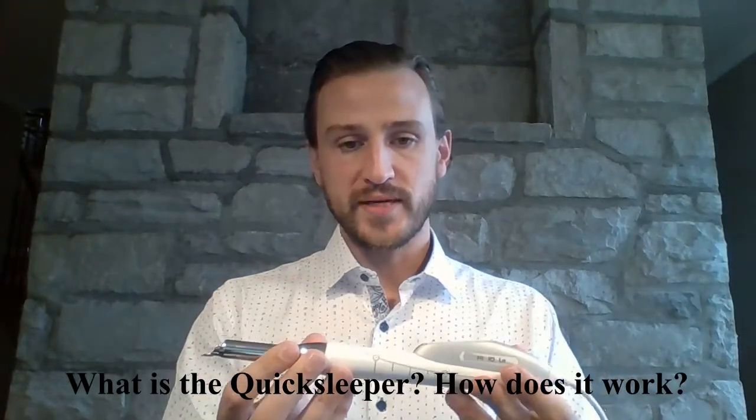Hello everyone, Trevor here from RWR Dental. I'm here to talk about what is the Quick Sleeper and how does it work. The Quick Sleeper is an electronic anesthesia delivery system that completely replaces the need for the syringe and the traditional nerve block technique, which is proven to be inconsistent and sometimes very stressful for the dentist and the patient alike, leaving the patient drooling and numb for hours. The Quick Sleeper is an innovative solution for these problems.